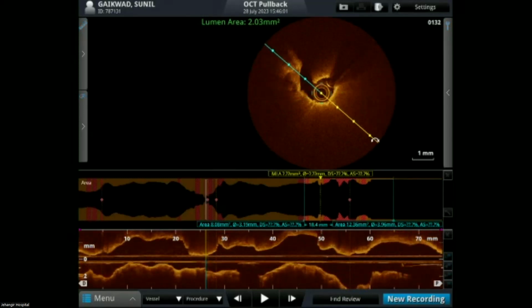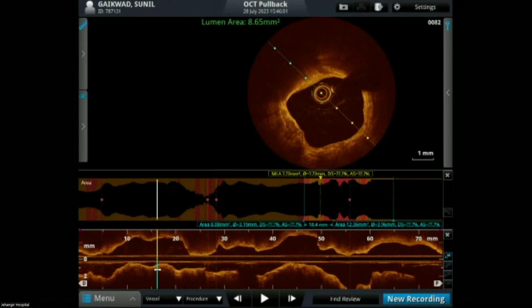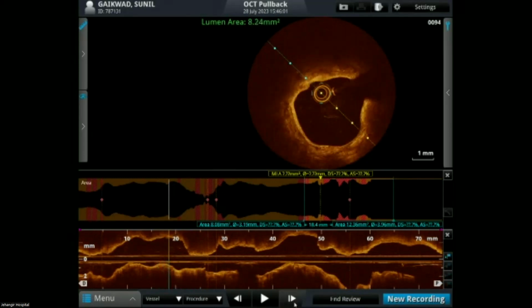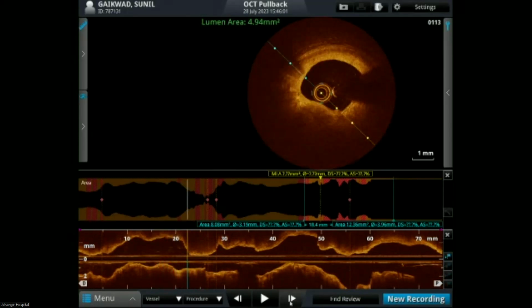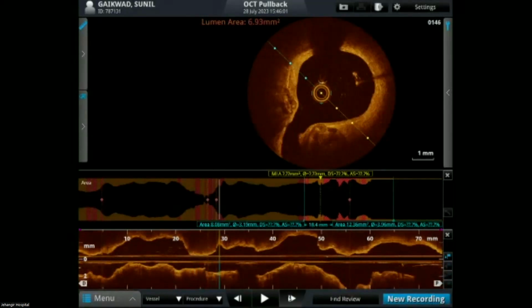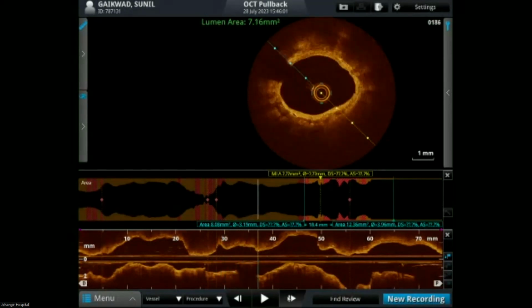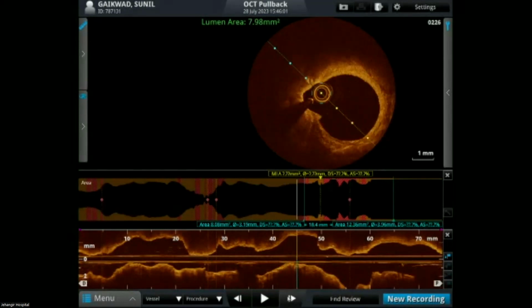The only thing is we have to be worried about slow flow, no flow, and ST elevation during the procedure. It's a more complicated procedure, but people have done it, and there's a lot of Korean work on this. So we thought we'll go ahead, because his RCA is the only main artery which has a problem. The LAD is not much. So taking that into consideration, we thought we'll go in for rotational atherectomy.